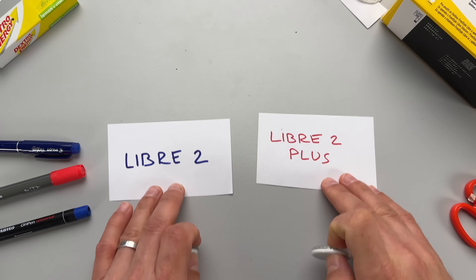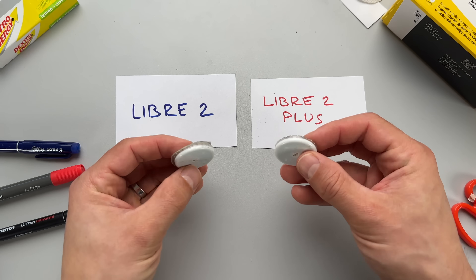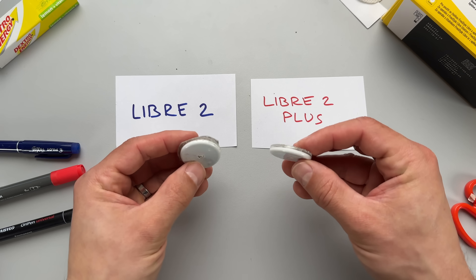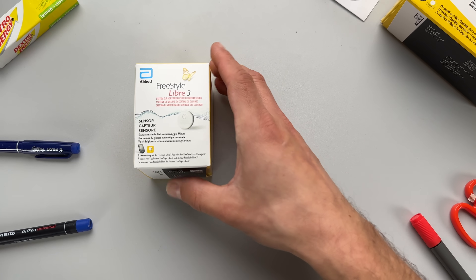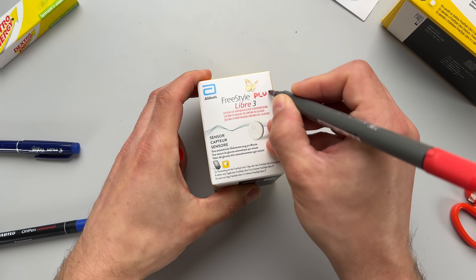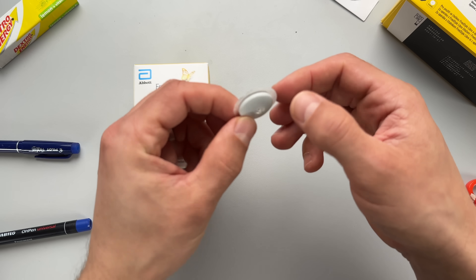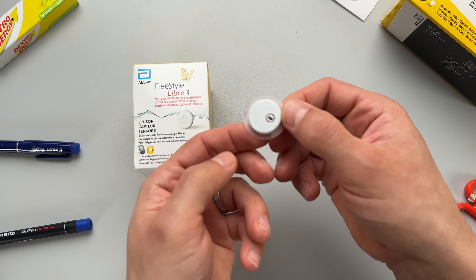Before we talk about even more Freestyle Libre improvements and what Abbott has in the pipeline for the next release, one thing that's not changing is the form factor. Freestyle Libre 2 Plus will have exactly the same size and shape as the old Freestyle Libre 2, and the price should also stay where it is. The same goes for Freestyle Libre 3, the smaller version of Abbott sensors. A Freestyle Libre 3 Plus is also in the pipeline, which will integrate with insulin pumps and retain the same shape and size as the current Libre 3.